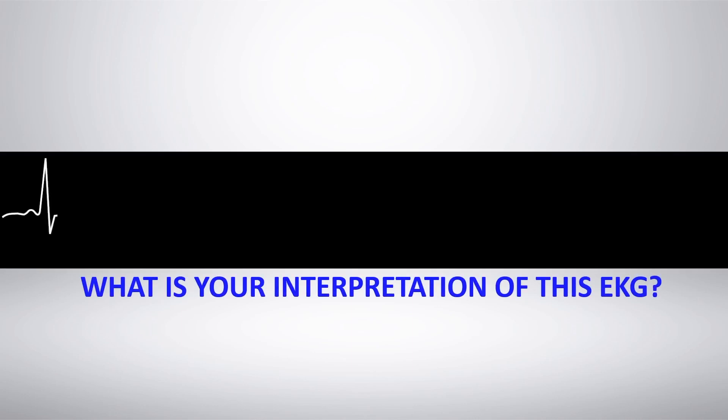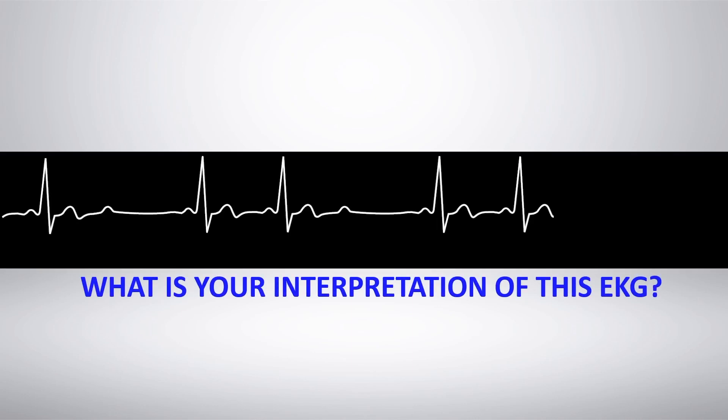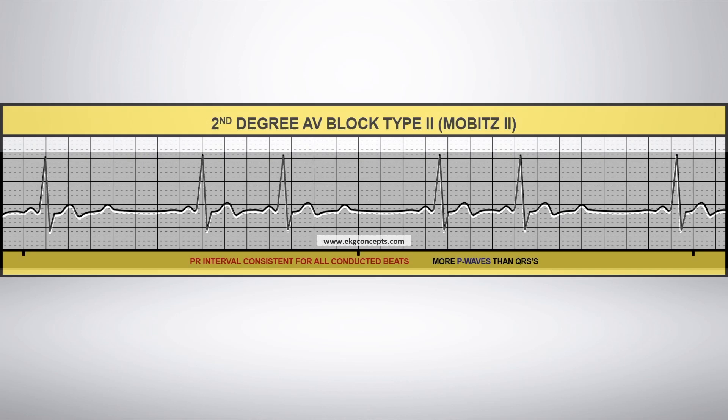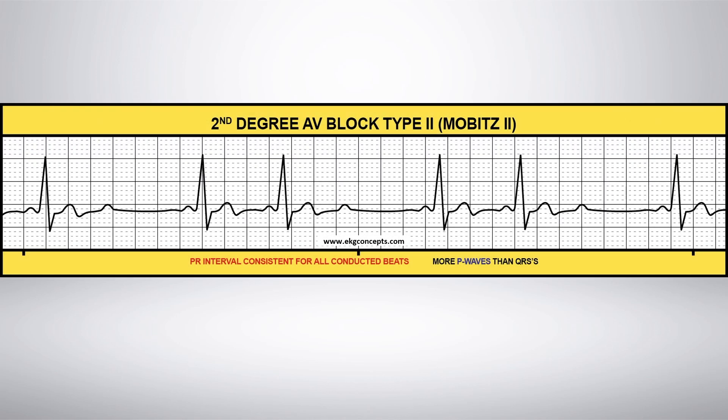What is your interpretation of this EKG rhythm strip? Second-degree AV block type 2, or Mobitz 2.